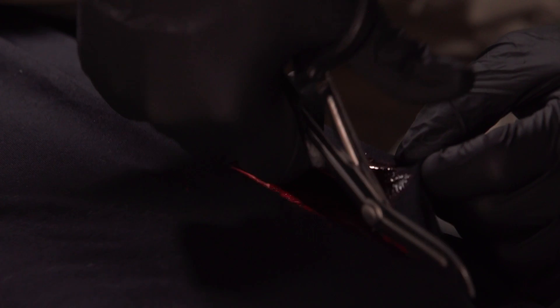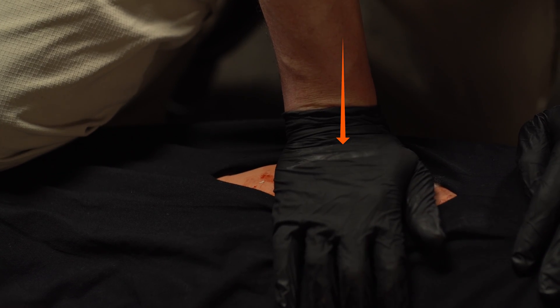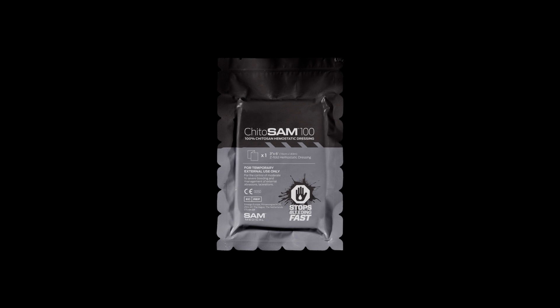Assess the wound location and severity. Apply direct pressure to the wound to prevent further blood loss. Select the appropriate dressing size.